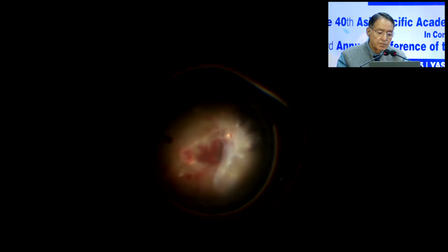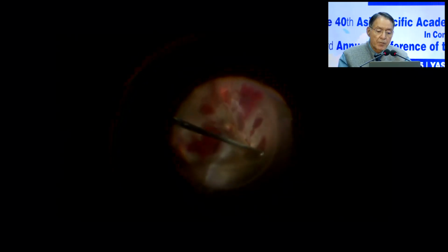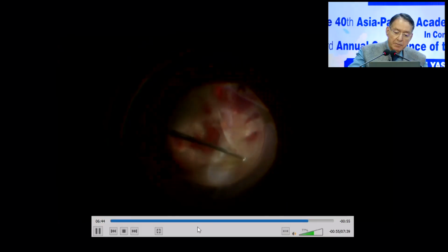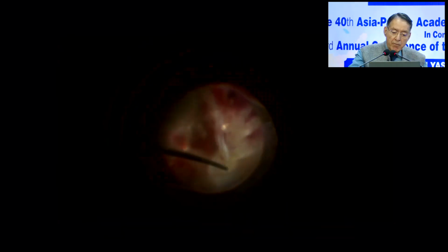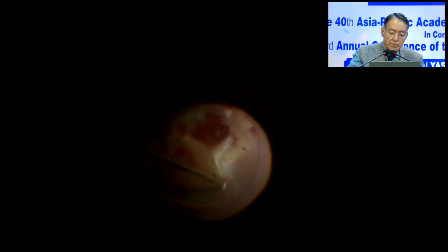When possible, we can segment the membrane to avoid too much traction on the retina during the separation. The posterior hyaloid was now separated temporally, and we can see parts of the membrane which were not very adherent also getting peeled off the retina. Finally, the superior extension was disconnected from the periphery and the rest of the membrane was delaminated bimanually.